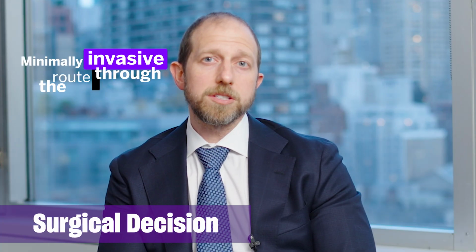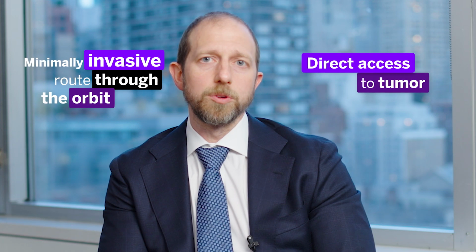That set of specific anatomic circumstances, as well as the location of the tumor, we looked for potentially less invasive routes and a more direct route to the tumor that would avoid the sinuses. So for that, we were leaning towards a transorbital approach, and specifically a transorbital endoscopic approach to access both the intracranial component as well as the intraorbital.